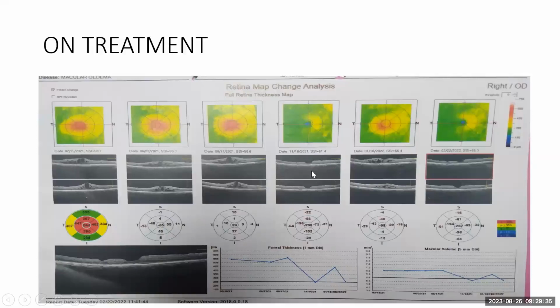So this patient, after this time, this November, is seen in January. When he's seen in January, you have some reaccumulation of fluid, okay? So you now see the foveal thickness is now at minus 98 compared to minus 298. And see, the map has gone up. So you scan, you check the map, you check the retina after you've checked the patient.